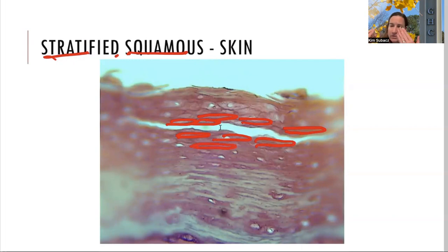That epidermis is going to slough off, and so you will replace your skin, and this is the stratified squamous on the skin. They are, again, for protection, because we definitely want protection on the surfaces of our skin. If it was simple squamous, that would not be good. No protection at all. We need stratified squamous.